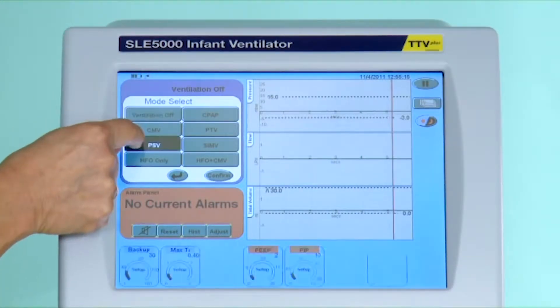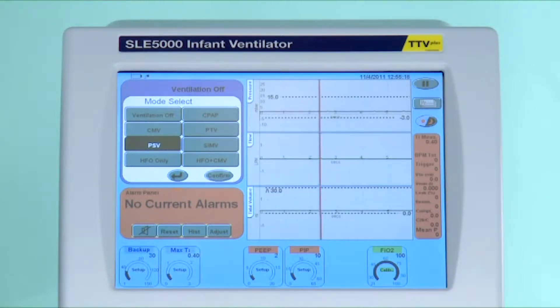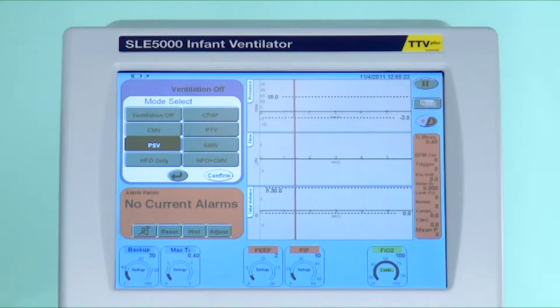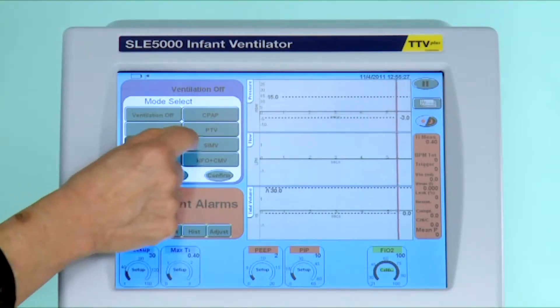PSV, or pressure support ventilation, is also patient triggered and will be set up exactly the same as PTV, but this mode has the all-important termination sensitivity.